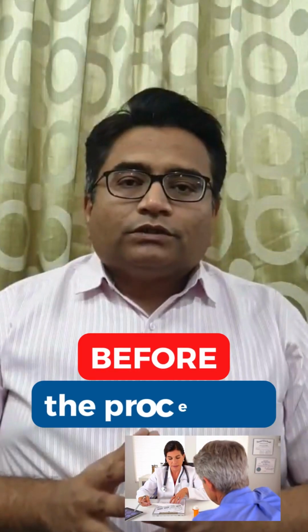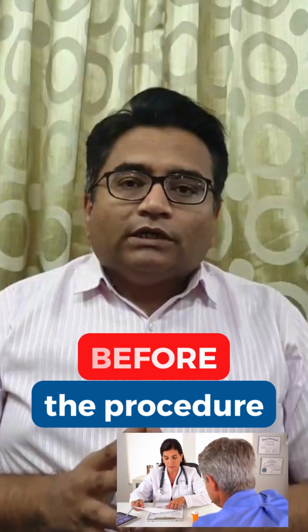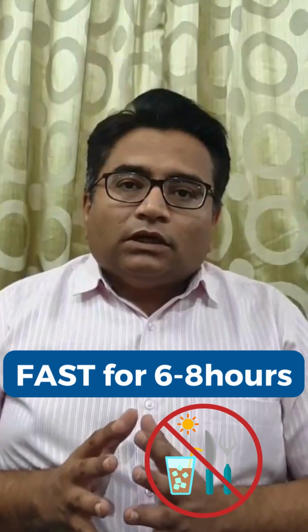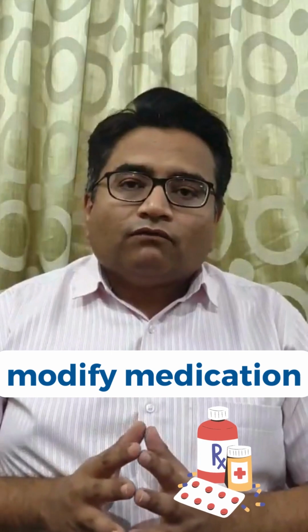So before the procedure, your doctor will ask you to remain nil orally. That is, you should fast for at least 6 to 8 hours depending on the indication for which the gastroscopy is being done. Also, you'll be asked to modify certain medications which you have been taking regularly for a long time. Also, you'll be asked to stop the blood thinners which make your blood thin and difficult to coagulate. You will be asked about your allergies and you should inform the doctor in detail about the allergies you are having and the treatment thereof.